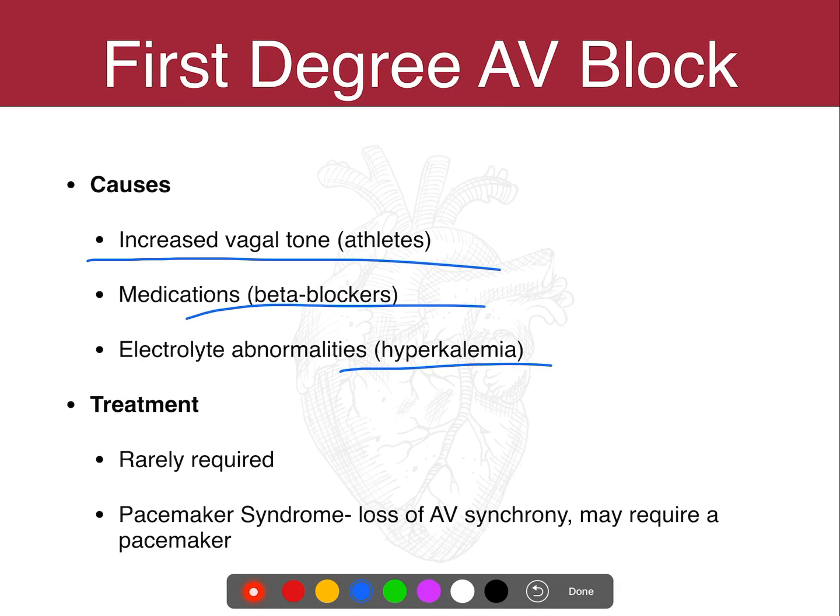Now, first degree AV block is rarely something that we have to treat or do anything about. We simply make a note of it on our 12 lead EKG interpretation.